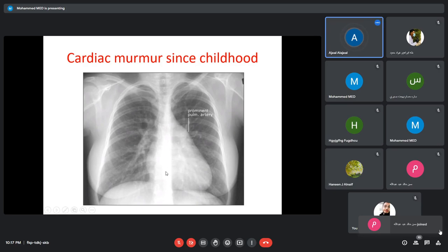In the middle, you take oxygen saturation, and checking the oxygen saturation is very, very simple. When you do cardiac catheterization, there's a technician sitting beside you, and you give him a drop of blood, and he gives you the result. If above is 70 and below is 68, you expect the middle to be 69. But in ASD, you'll find that in the middle, probably it's 86 or 90. Why? Because oxygenated blood is mixing with deoxygenated blood. Oxygenated blood is shifted from the left side through the ASD to the right atrium. So this is the way you diagnose atrial septal defect by cardiac catheterization.